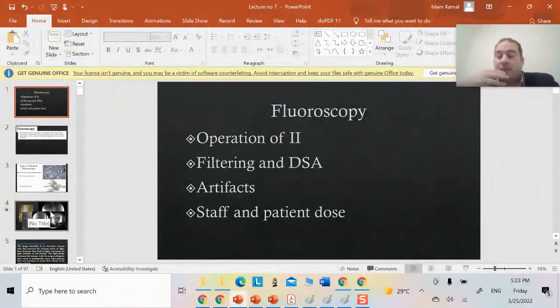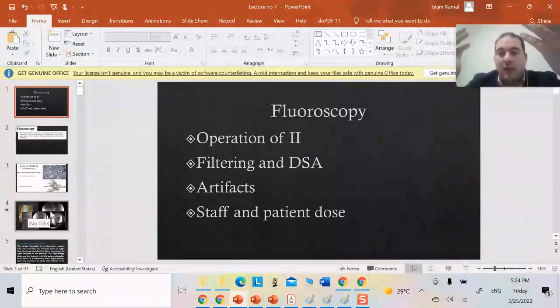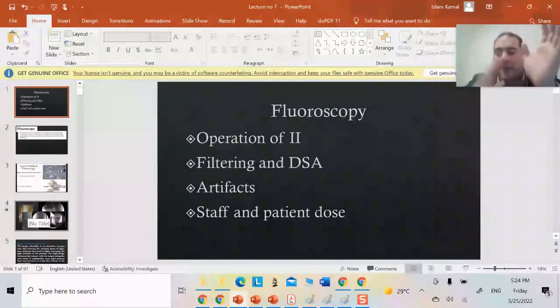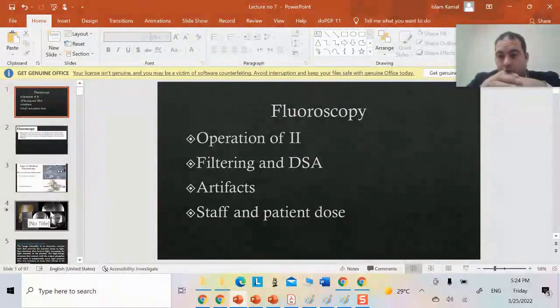And in the end, this image will be displayed on a video screen, where I can see my image while I am working. I can set it to see it clearly. I can specify, for example, how many milliseconds I want for a specific image in a certain mode, or even if I want a specific image, I can do that. The detector is a story all about fluoroscopy.